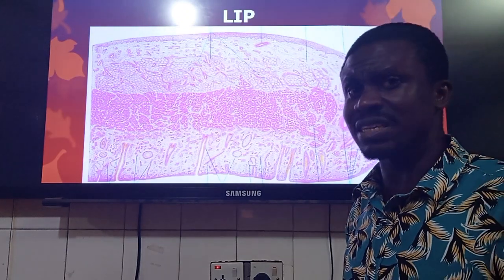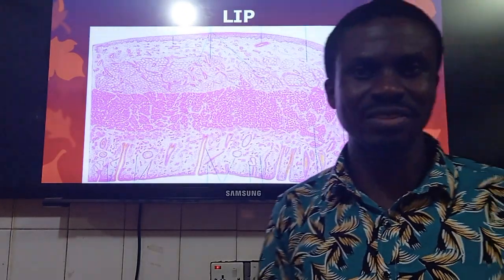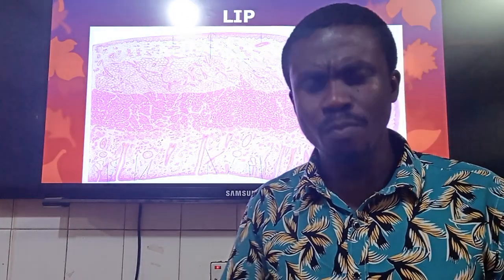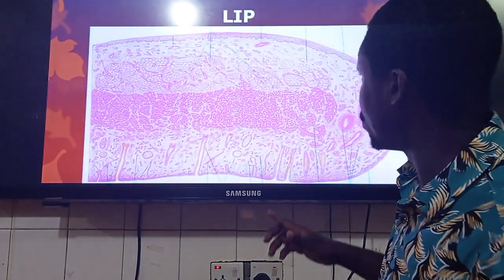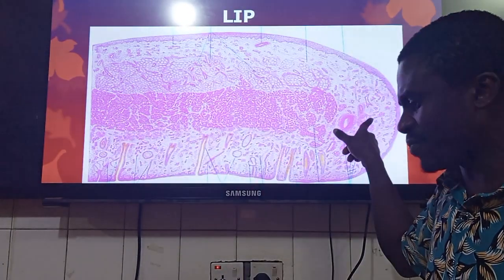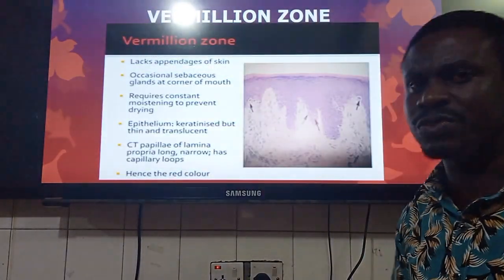And whenever I talk about skeletal muscle fibers, we are talking about fibers, cylindrical in shape generally, having peripherally placed multinucleation. That's one thing we see. Now, explaining this one further, I have this slide to tell you something.